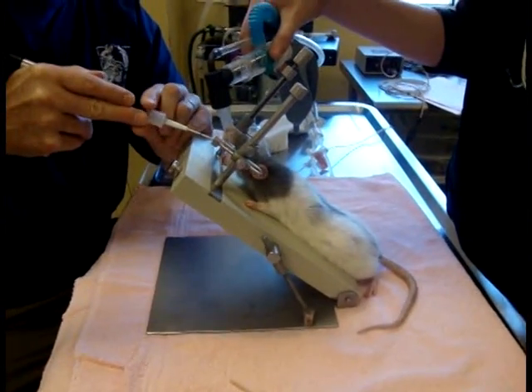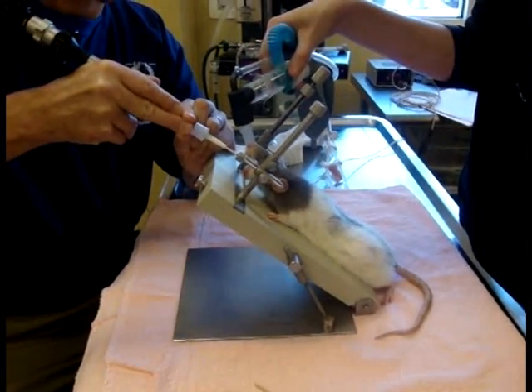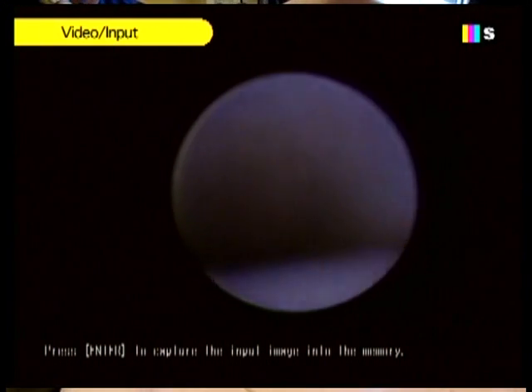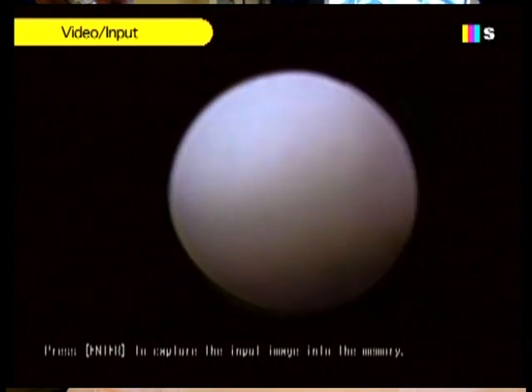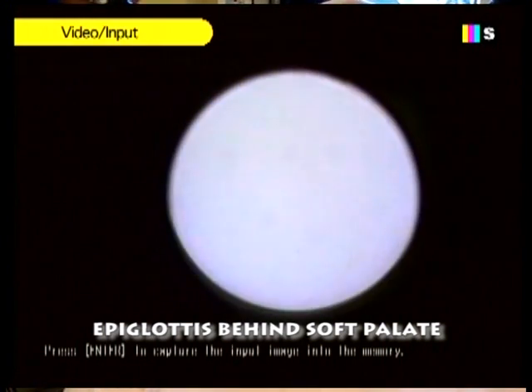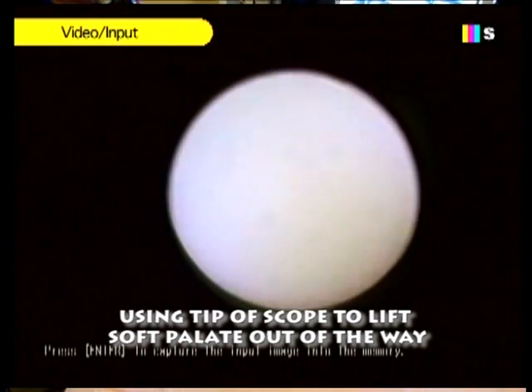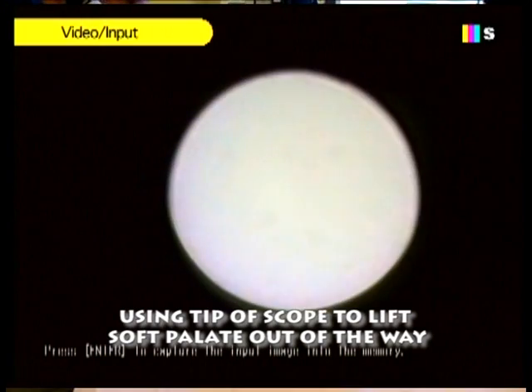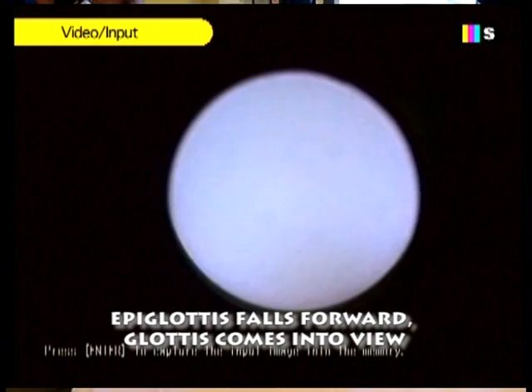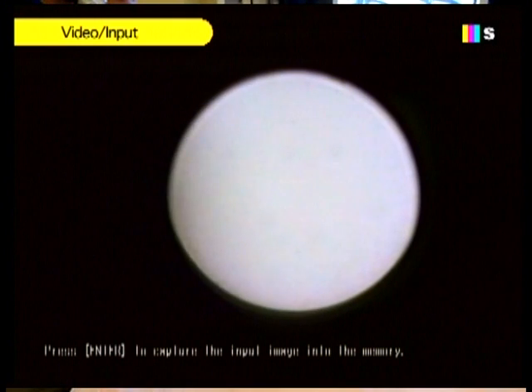I'm going to advance in over the base of the tongue. I can see landmarks on the roof of the mouth — there's the base of the tongue, the papilla on the tongue, and there we have the epiglottis behind the soft palate. I'll push up and push the soft palate out of the way to expose the epiglottis. And we have the arytenoids — and we intubate.